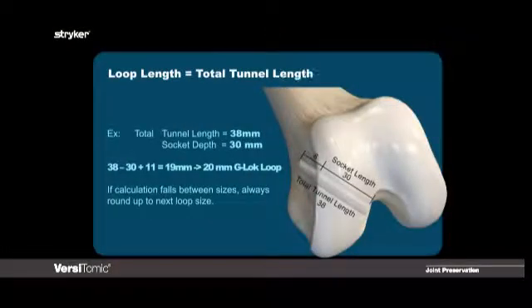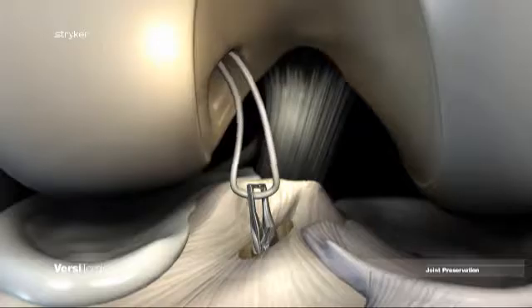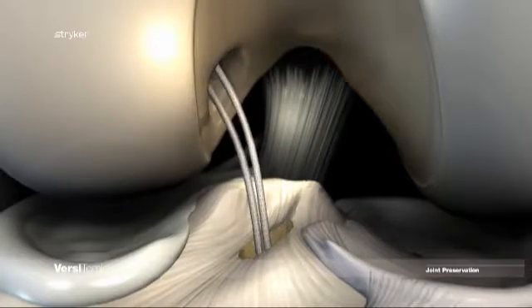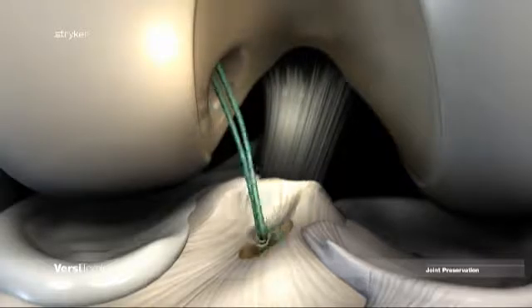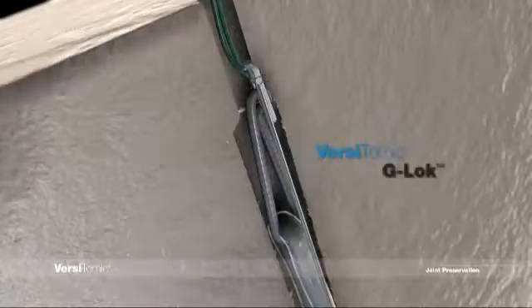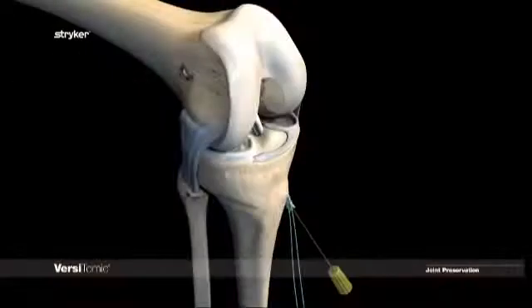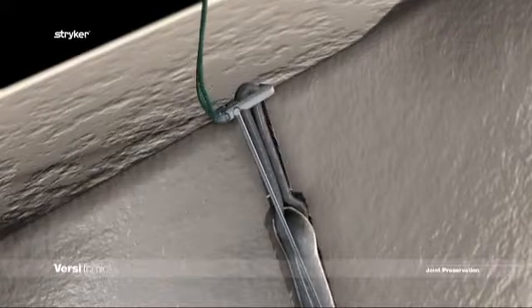Selection of G-Lock loop size is determined using outside-in depth gauge measurement and socket length. Utilize a loop retriever to grab the passing suture down through the tibial tunnel. Insert the lead suture tails of the G-Lock through the loop and pass the sutures. Using the G-Lock lead suture, pull in the same direction as the femoral tunnel to pass the graft. Confirm the G-Lock has flipped by pushing up and pulling down on the rod to feel the button lift up and seat back down on the cortex.